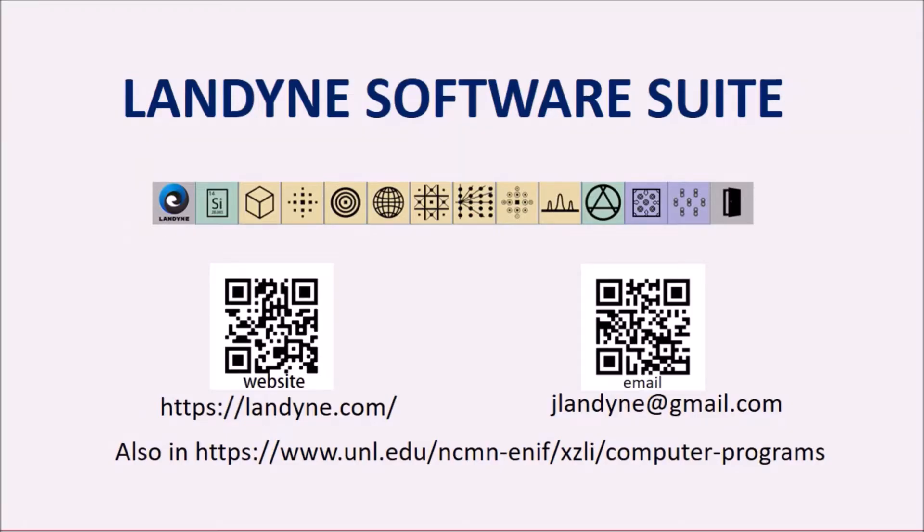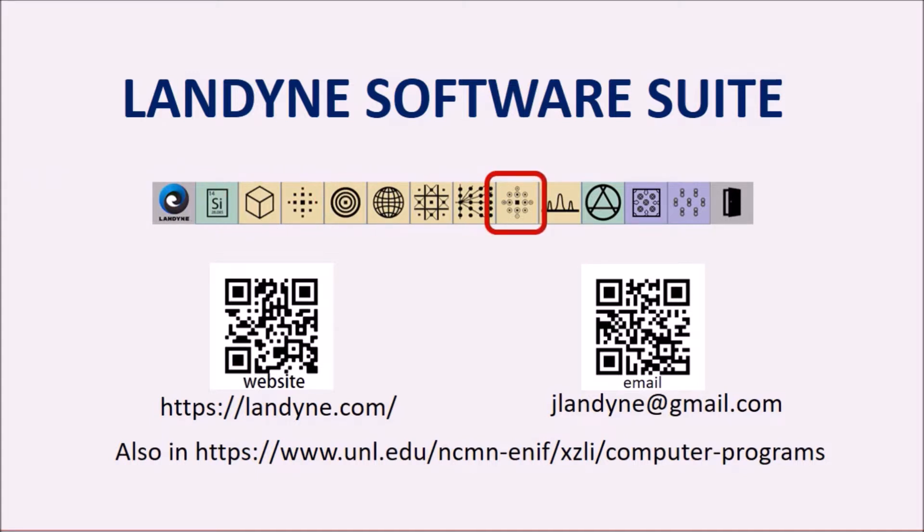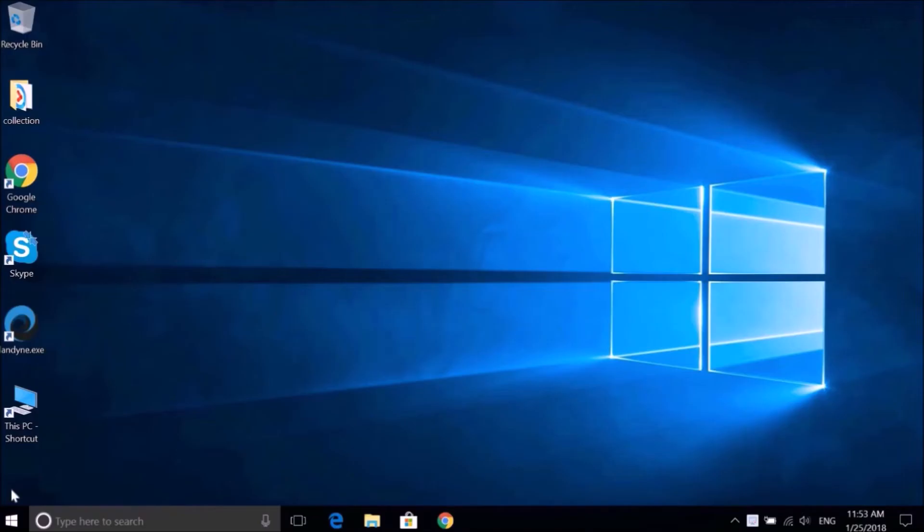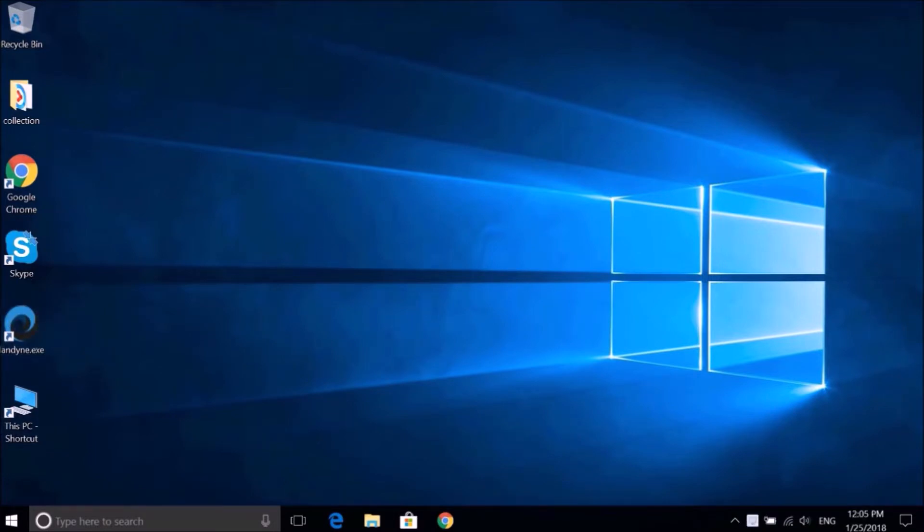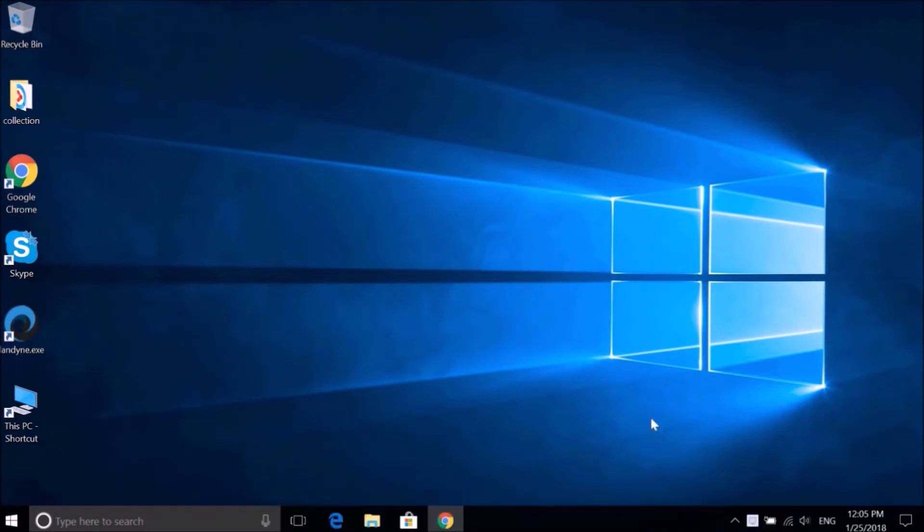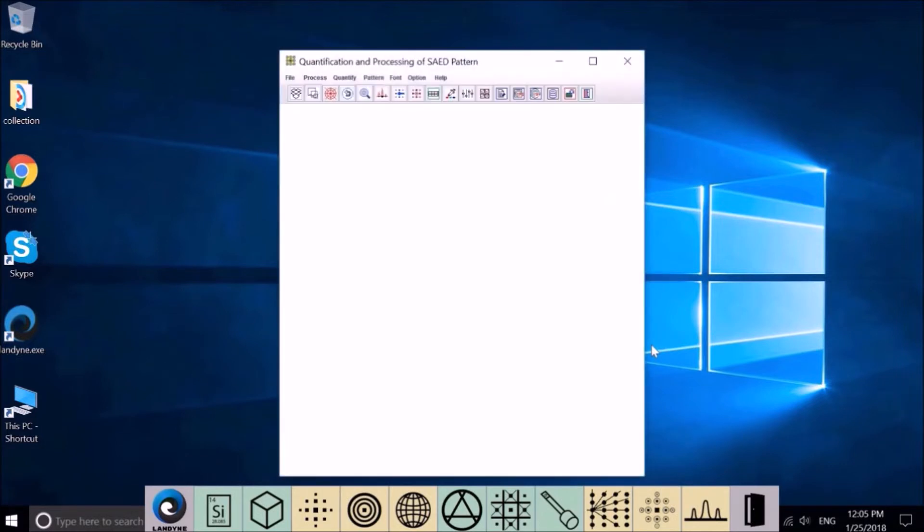In this tutorial video, I will introduce QSAED, a computer software for quantification and processing of SAED patterns. You may download the software suite from the website on the screen. Here is the Landyne launcher icon. Click this button to start QSAED3.